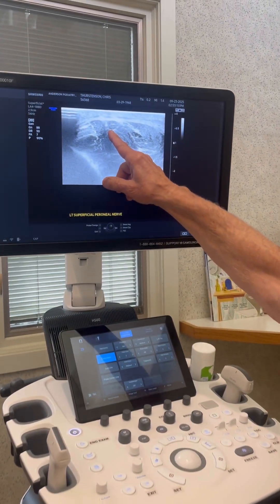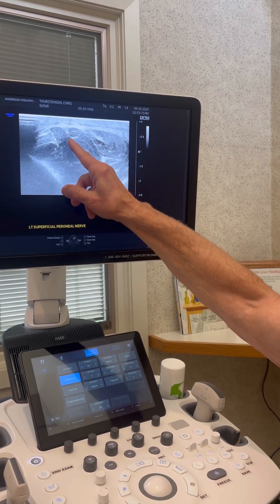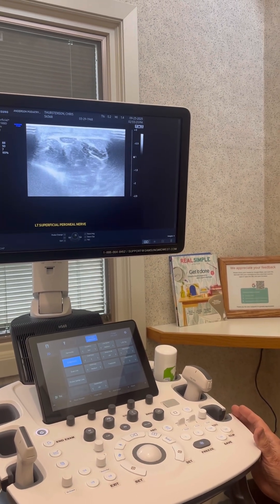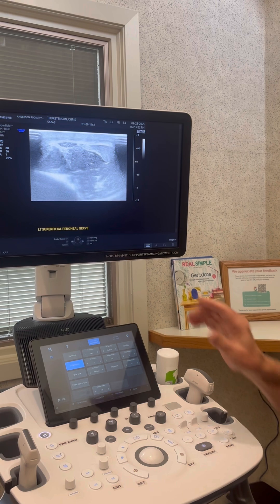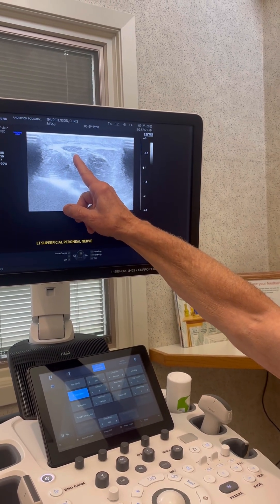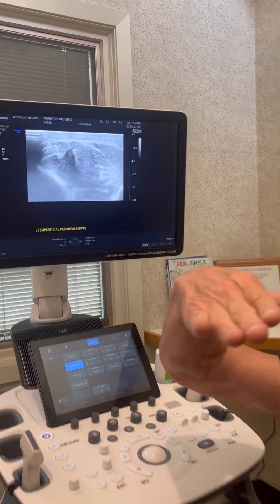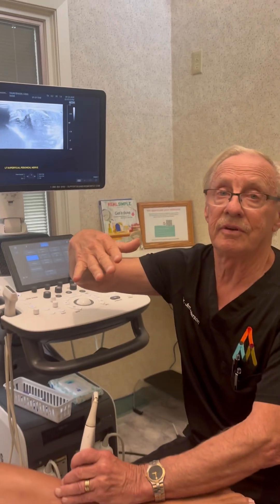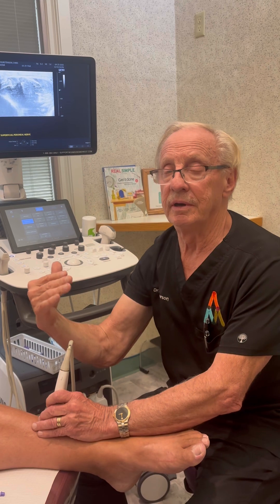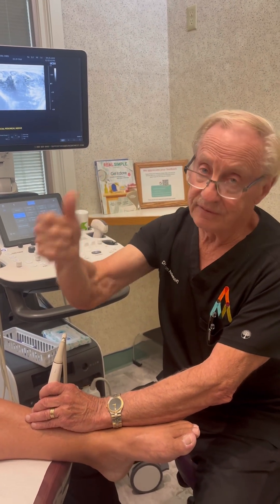This one is called the superficial peroneal nerve — it's right above the ankle. If you look up here, that dark area is the actual nerve. The white band across the top is the fascia — it's like gristle tissue. As I move the probe down, you can see the shape of the nerve changes; it becomes very flat, like a pancake. As I move back up toward the knee, it becomes rounder. That shows there's pressure on the nerve — the nerve actually changes its shape. It comes down the leg from underneath that fascia on the outside. What you saw is physical evidence of pressure on the nerve.